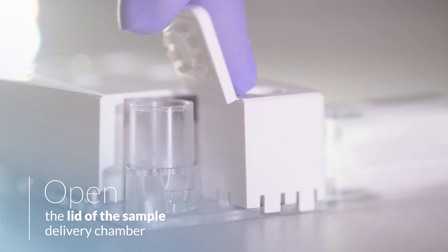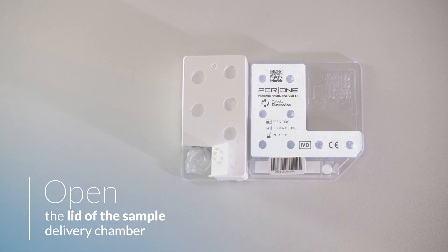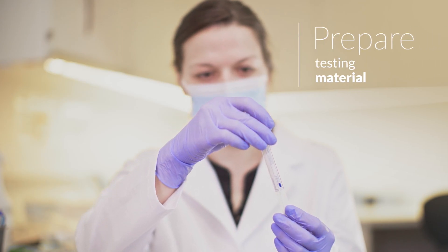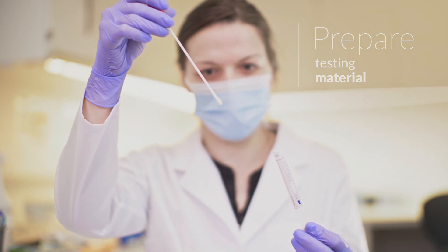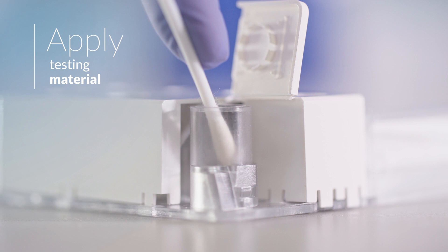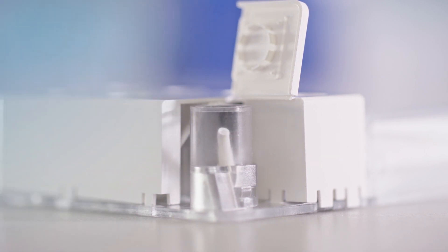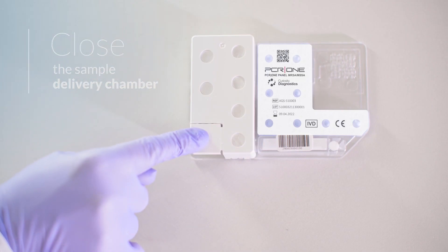Open the cover of the sample well on the panel. Do not rotate or excessively tilt the PCR1 MRSA MSSA panel after opening the sample well cover. Remove the swab with the sample from the transport tube. If there is a visible lump of nasal discharge on the swab, remove it by wiping the swab with sterile gauze or tissue paper. Place the end of the swab in the sample well on the panel and then break it off. Close the sample well cover tightly by pressing it down until you hear a click.